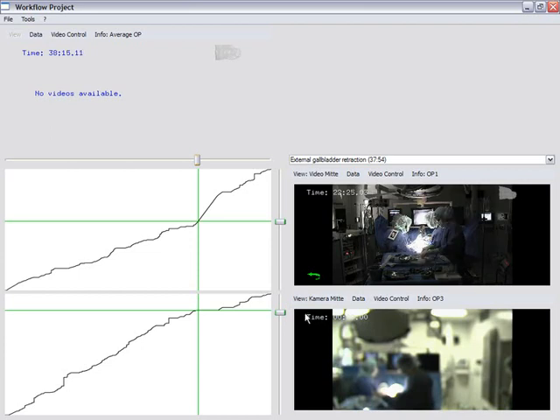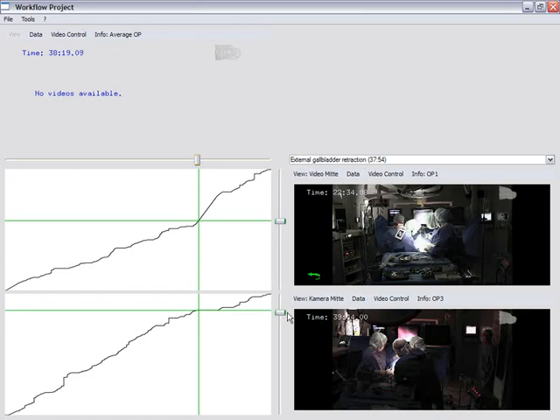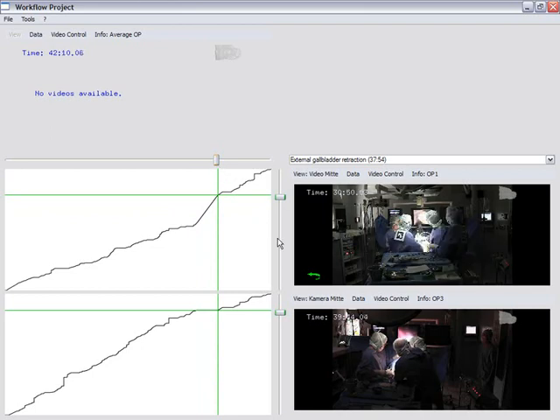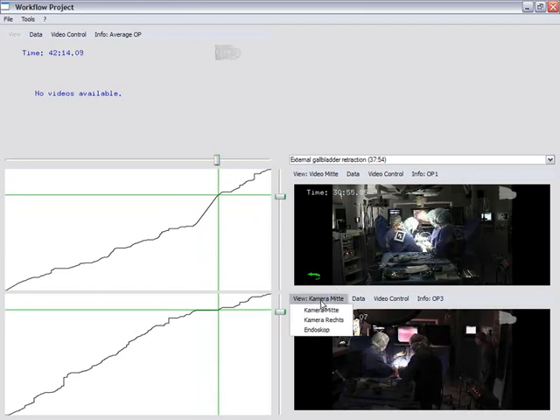Each surgery consists of an extensive dataset. It contains up to 3 external videos of the surgery site. In addition to that, each dataset features a laparoscopic video stream of the surgery. Instrument state vectors over time represent each surgery in an abstract way. They allow us to synchronize the surgeries and obtain the time warp paths on the left.